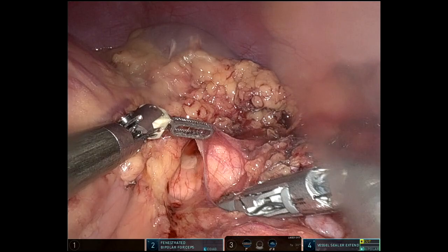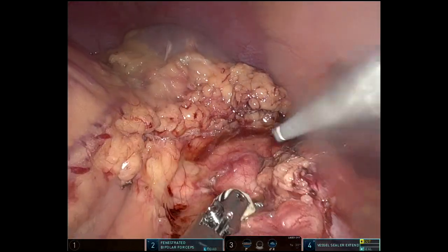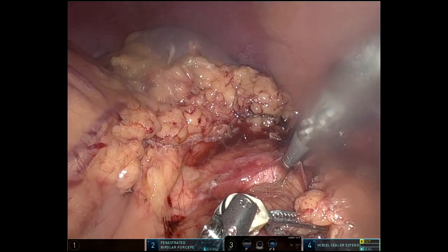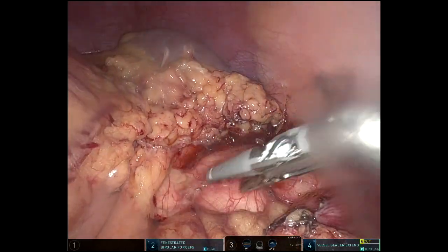That's most of the splenic flexure mobilization. I'll do some more medialization of the colon to make sure I've got all the length I can get — and it was sufficient.